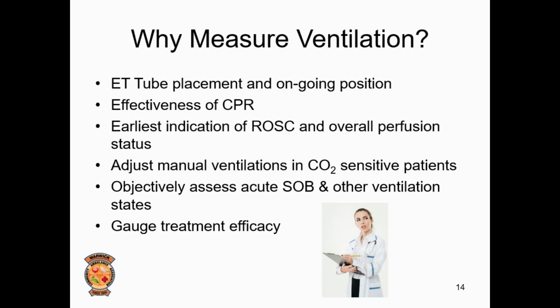We'll talk about the role of capnography in the head injured patient a little bit later in the presentation. You'll be able to see how severe a patient's bronchospasm is based on the waveform and how effective or not your treatment is, all based on the capnography waveform.